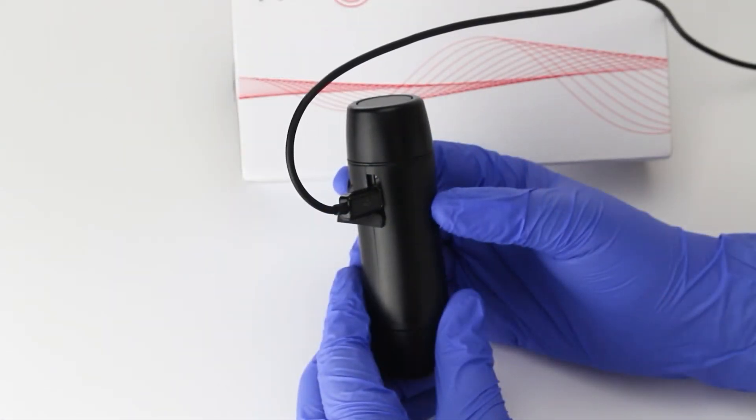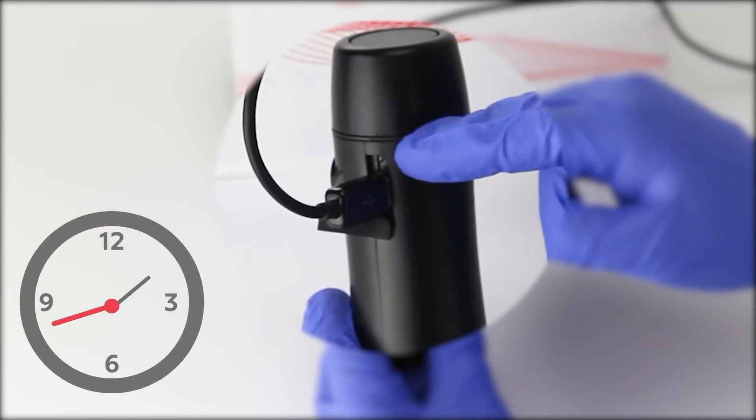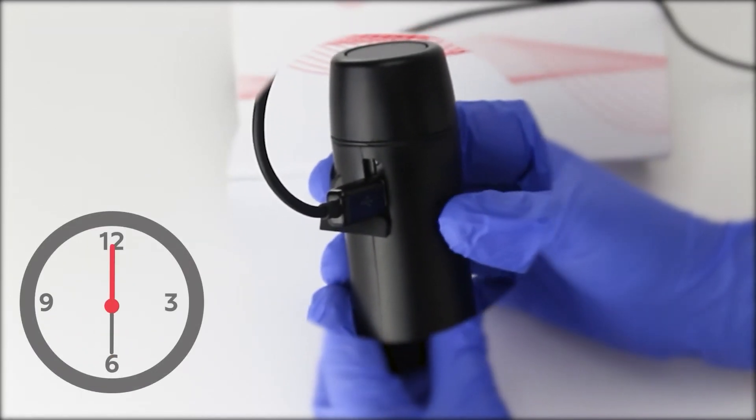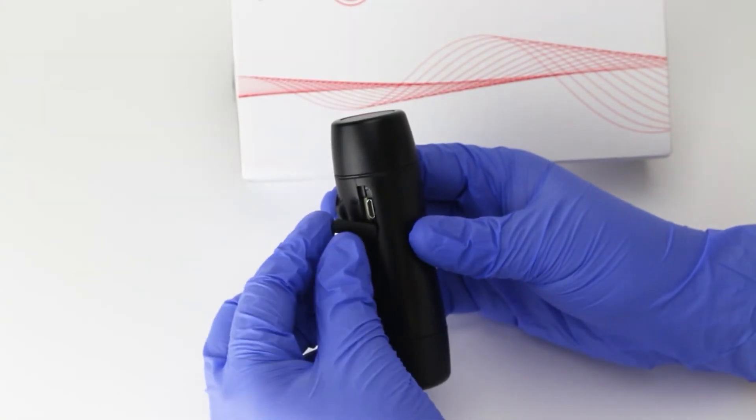Once the electrolarynx is fully charged, the LED light will begin to flash. This typically takes four to six hours to complete. Then remove the charger and place the USB dust cover over the USB port.